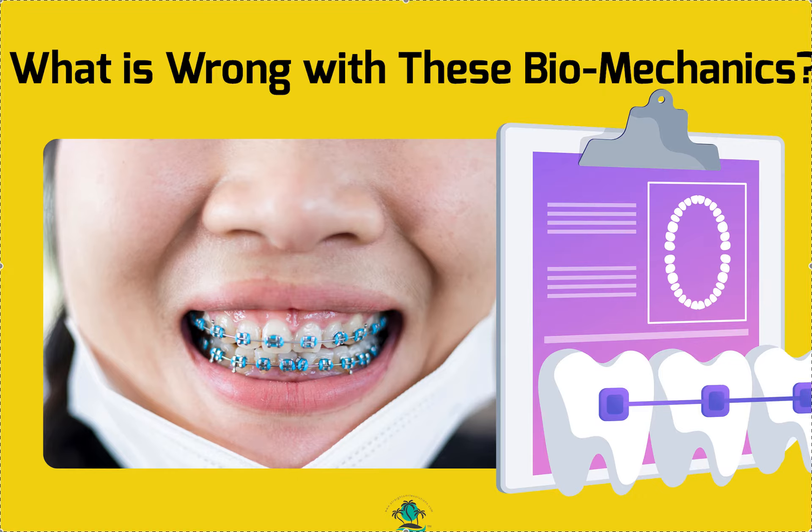Hey, it's Dr. Amanda with Straight Smile Solutions — straightsmilesolutions.com. Today we're going to talk about finding what is wrong with these pictures to show you what I see, what may work, what may not work, and maybe what you would do differently. So I'm going to give you a second to take a look at this picture. If you're watching this video you probably already have the answer, but what do you see? What would you do different?